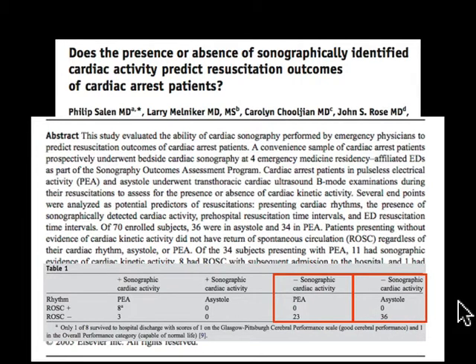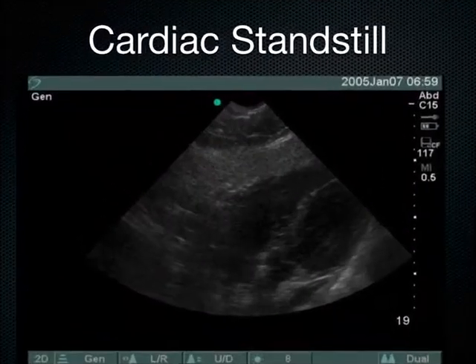There's a study going on right now. There's 61 sites. We're one of the sites looking at this exact same concept called the REASON study that Rod Mortazavi, one of the medical students, is sort of in charge of. And so we're looking at that now as one of the many centers doing this to try to find, is there any situation in which a patient could actually survive who had cardiac standstill on their ultrasound. This is what it looks like right now.